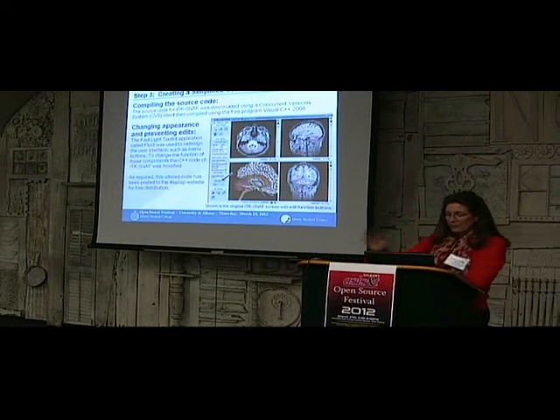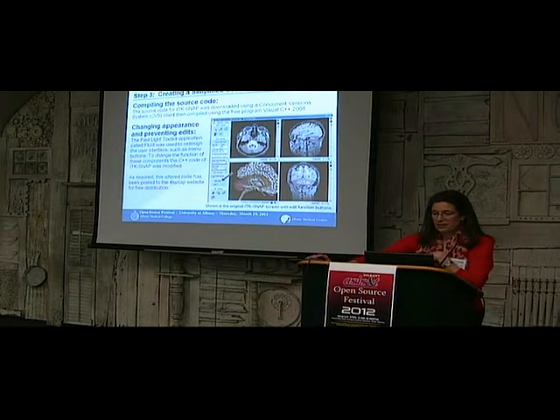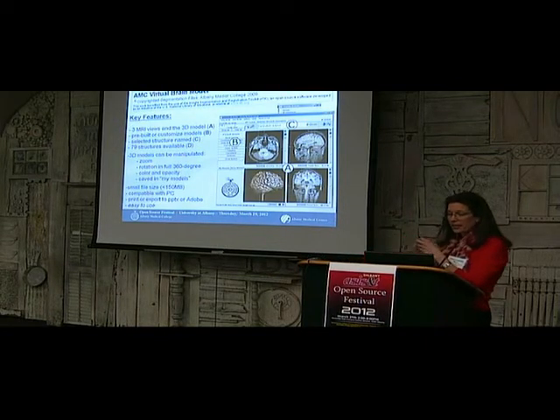And so once all this was done, we reposted the altered code as required by this Berkeley-style open source software back to the original ITK Snap site, and made this available to not only our students, but anybody that wanted to use it by simple license and download from the Albany Med website. And this is what it looks like now.